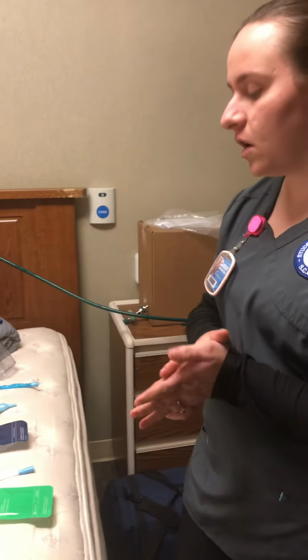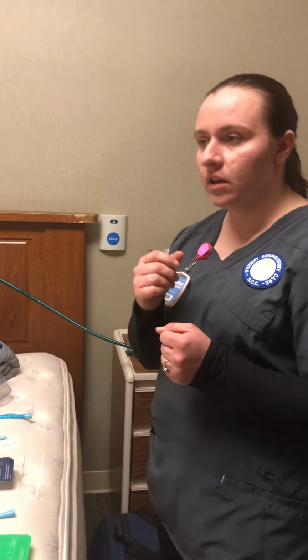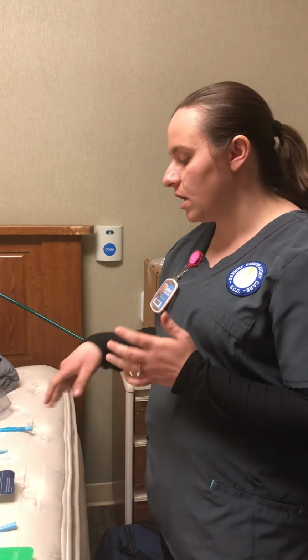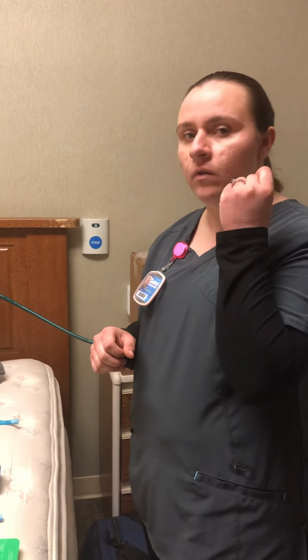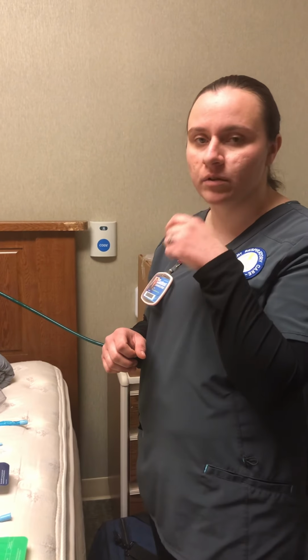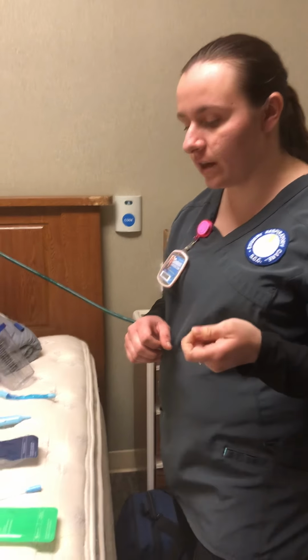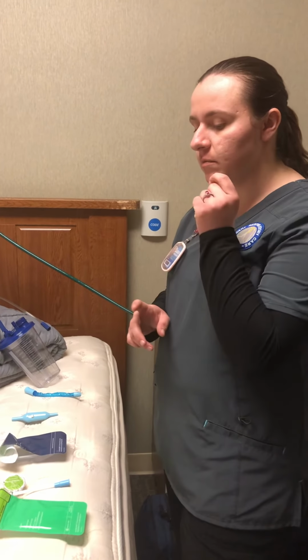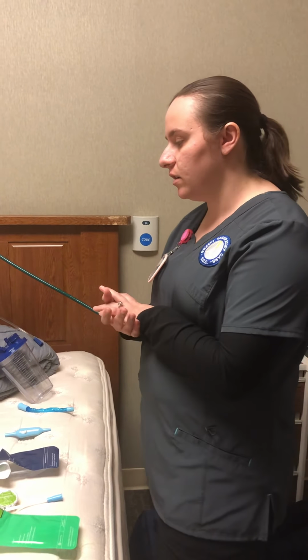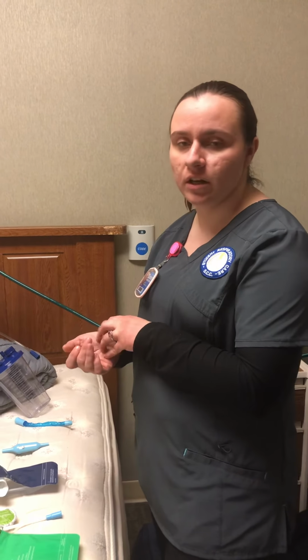So when you're all finished, always double check the placing of your endotracheal tube, and also when you're doing your cares, some of them you may have to remove the straps. If it's one of those straps that you have to replace, always hold the tube in place when you're doing that. But when you're all finished, always check the placing, the lip level of your tube, and get the vital signs after you're done. Make sure everything still sounds okay, and always check the settings on your machine.